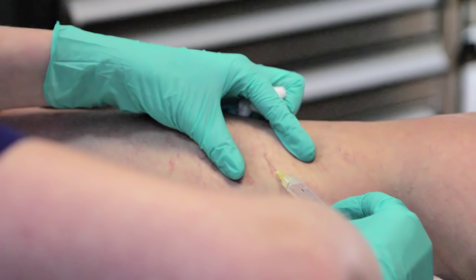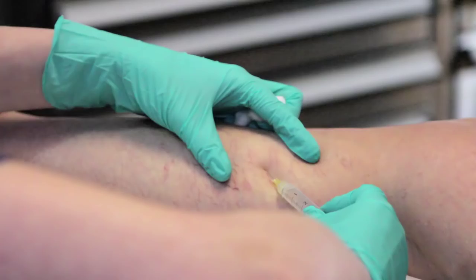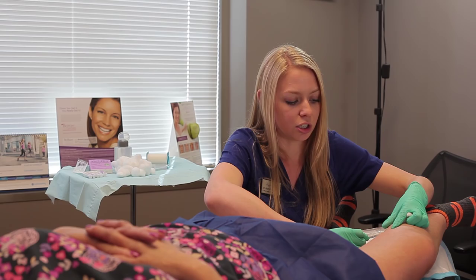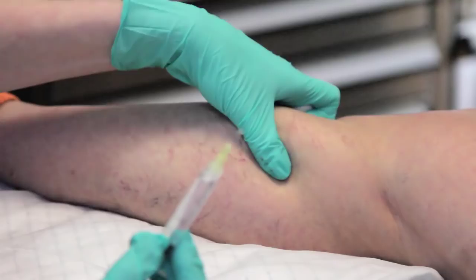A tiny little injection right into the spider vein and you can watch it just blanch away. What I do is just keep injecting until I see a tiny little bleb. That bleb just lets me know that we have enough solution in the spider vein and then I can go ahead and pull out. Next I just lightly massage that area, pushing the sclerotherapy straight through the spider vein and helping it deliver to the other patches.